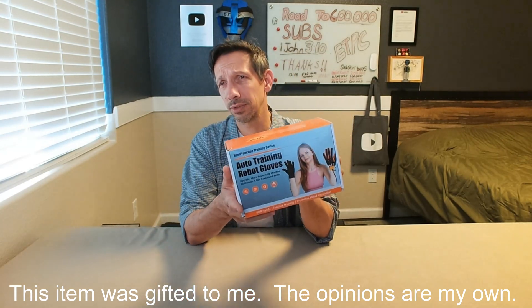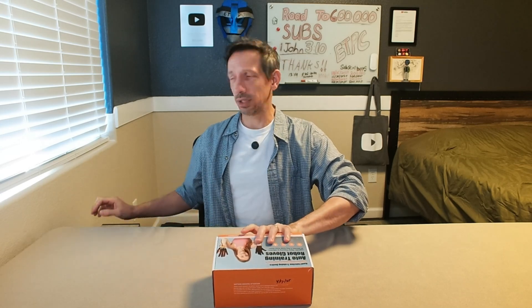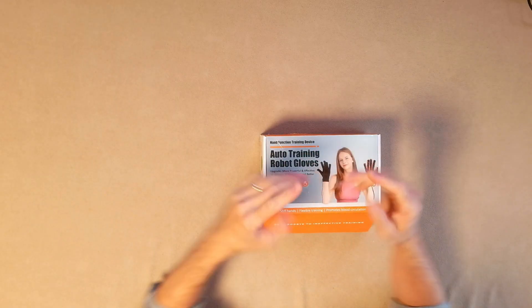Hey there friends. Welcome to another unboxing review. Should be kind of an interesting one — these auto training robot gloves. I guess this is for patients who need some rehabilitation.